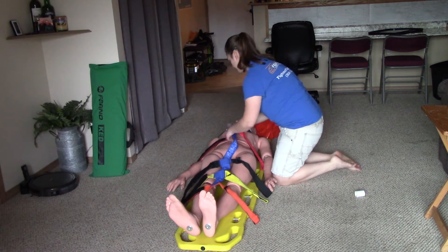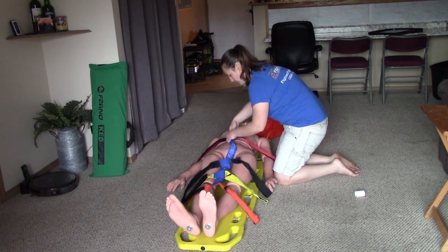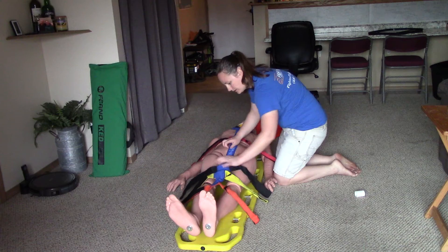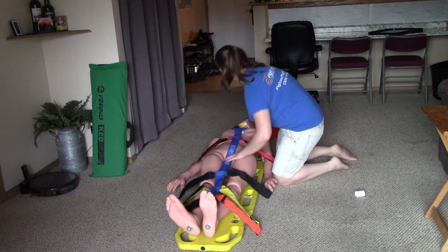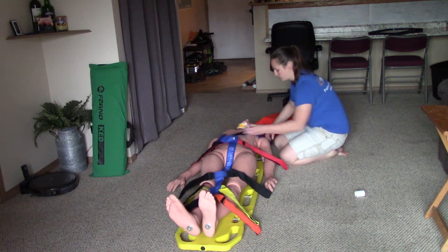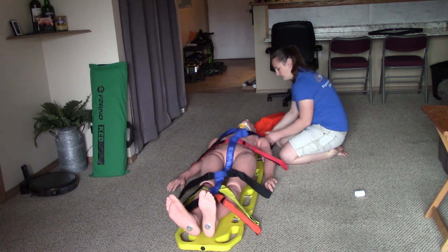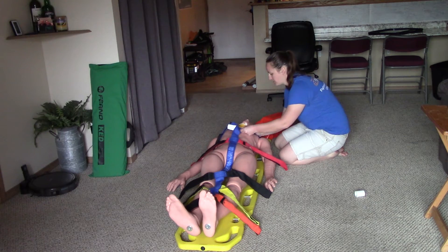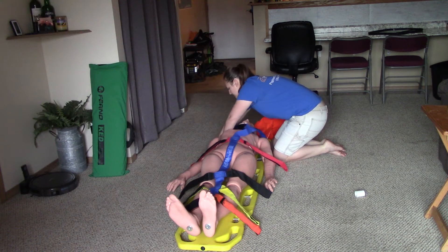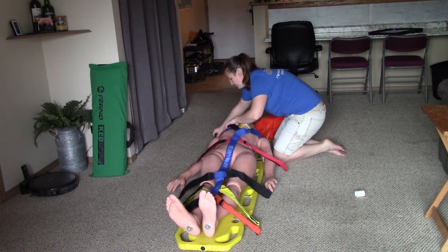Line up all the straps. My goal is to have the blue piece down the middle be untwisted and straight. Just like with the last straps, we're going to start with the shoulder straps. They're going to go the same way around the backboard with the Velcro in. I'm not going to worry about getting them too tight yet — just getting them on the patient. Reaching over the patient is fine; we just don't want to step over them.